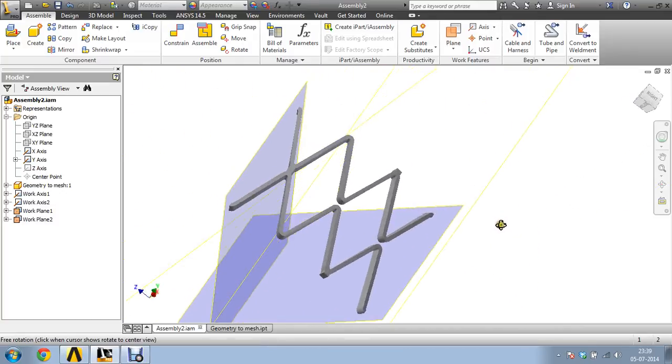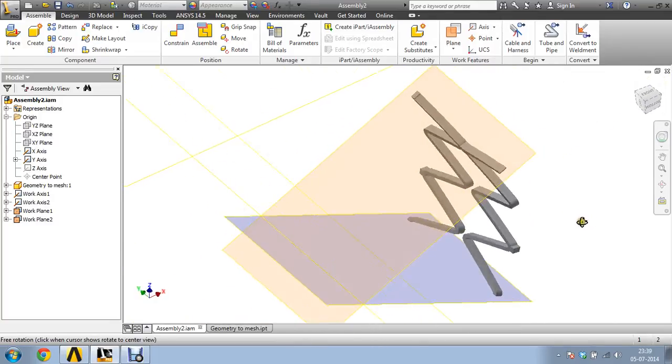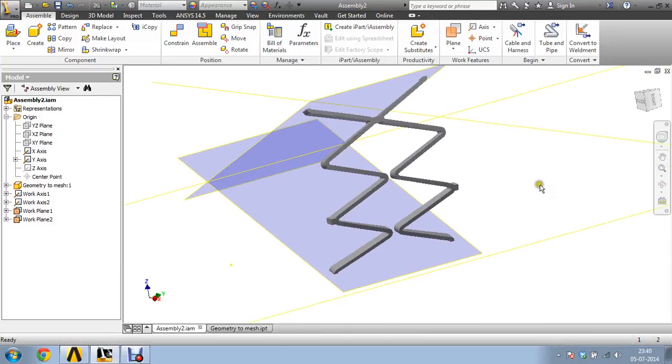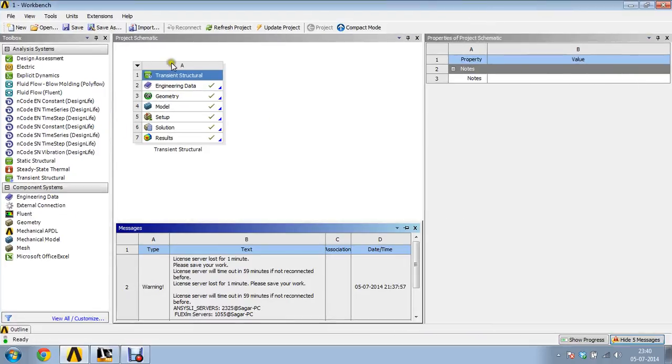Okay, so let us see what can be done on stents. What I'll do is export this model into ANSYS, and we'll make use of ANSYS transient analysis to do an FE analysis on it. So I have already opened an ANSYS module. This is transient structural, and now I'll be going into the model. I have already performed an analysis and done all these things. So we'll go directly into the model.